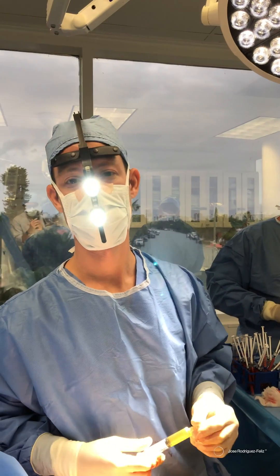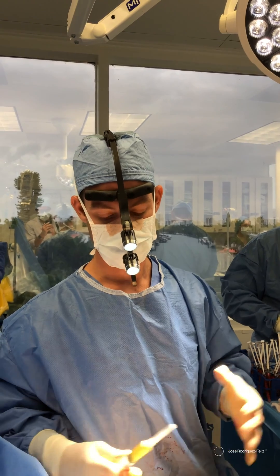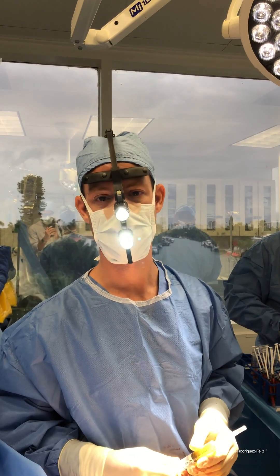Today we're doing fat grafting to the labia majora. This is done for vaginal rejuvenation.